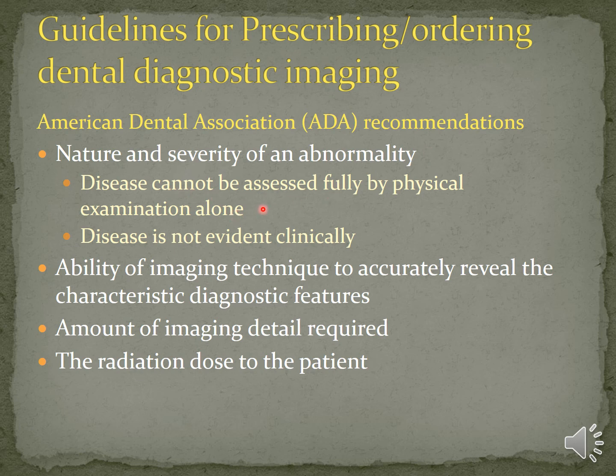Let me give you the simplest example where x-rays are used in dentistry. For example, you have a patient who's come to you with a deep dental caries, and you're trying to assess whether the pulp is involved. Should the patient go in for root canal treatment? Is there a periapical pathology? That is something which you cannot see convincingly only with clinical examination. You need an x-ray to assess the depth of caries, as well as to understand if there is a pathology at the apex of the tooth, and begin root canal treatment, right?